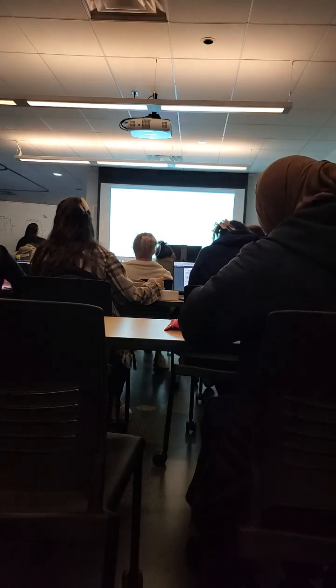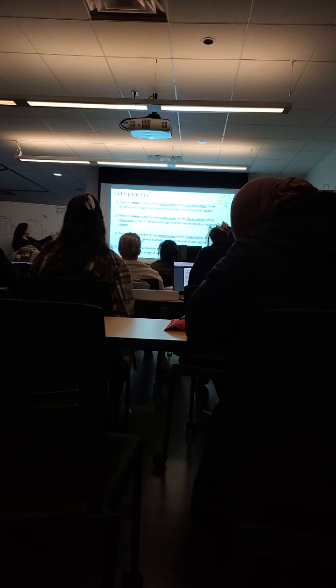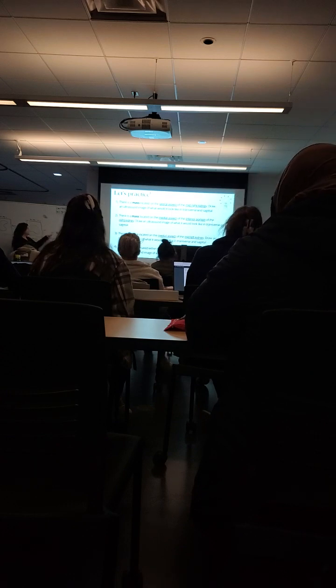I bet you anything, this is where it's going to be, because they said lateral. They didn't say superior. They didn't say inferior. They didn't say anything else. So the most lateral will have it. That means in the mid, you're not going to see anything. There's going to be nothing in the mid.